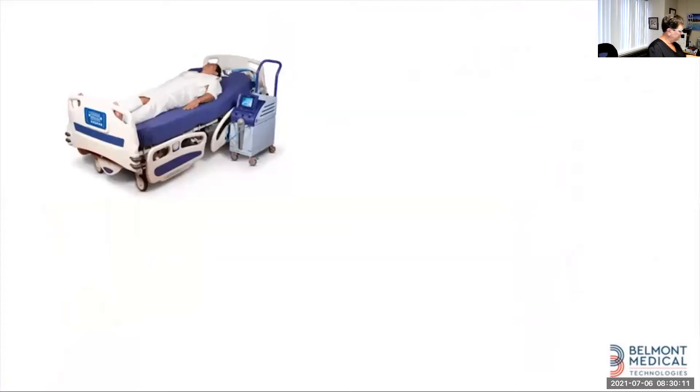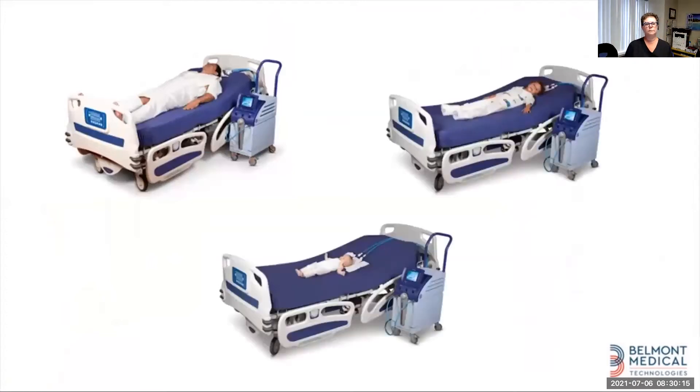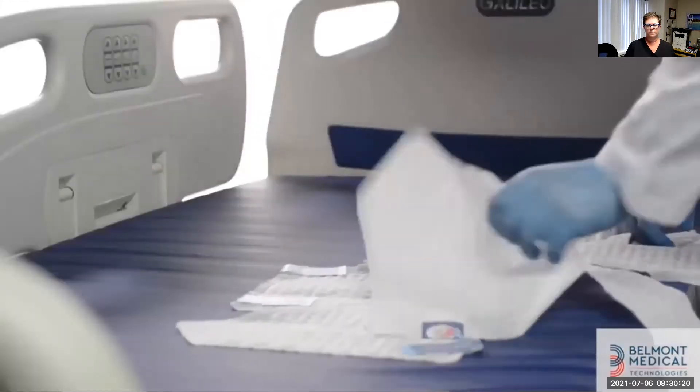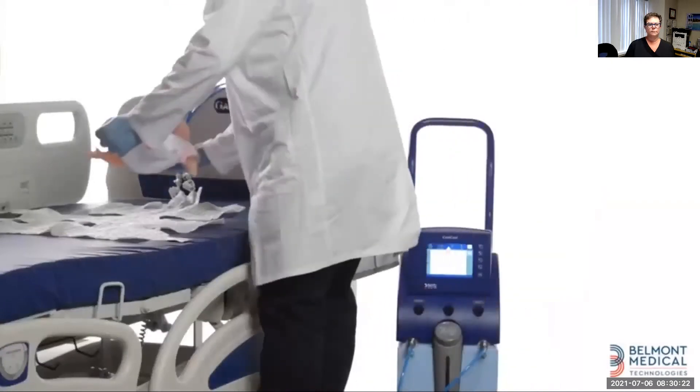Choose the appropriate cure wrap for your patient. We provide adult, pediatric, and infant cure wraps in different sizes, which give a full body coverage. Open the wrap on the bed. Position the patient as shown.